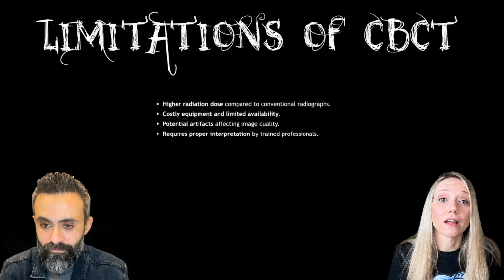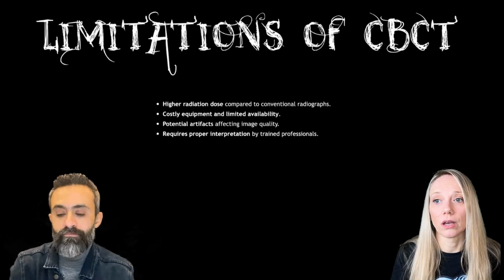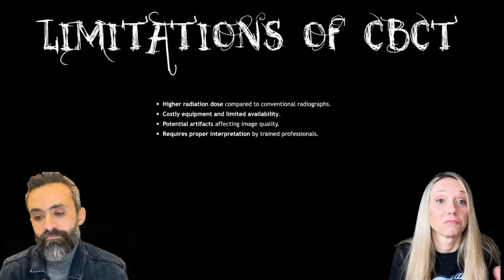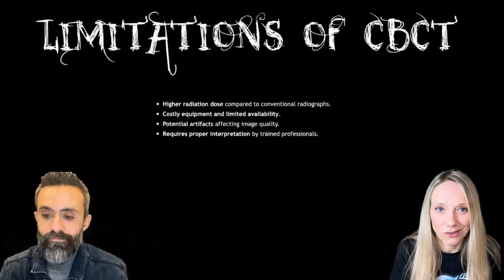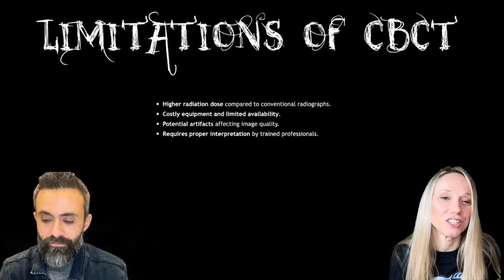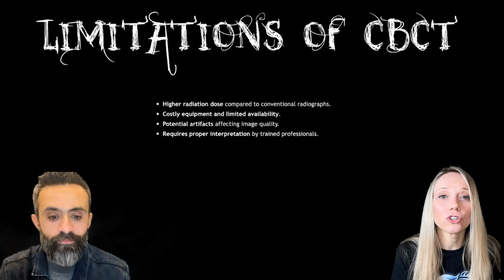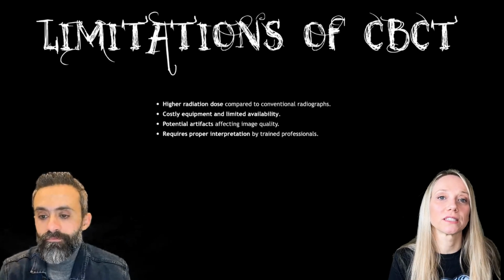And then, of course, there are some potential artifacts that can affect the quality of the image. Let's think, for example, about the quality of the machine used for taking the CBCT. There are very different machines with different images and different qualities, but also the conditions in which we take the CBCT.